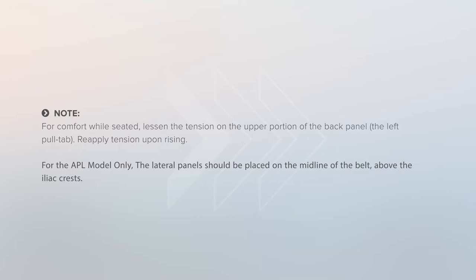For the APL model only, the lateral panel should be placed on the middle of the belt, above the iliac crest.